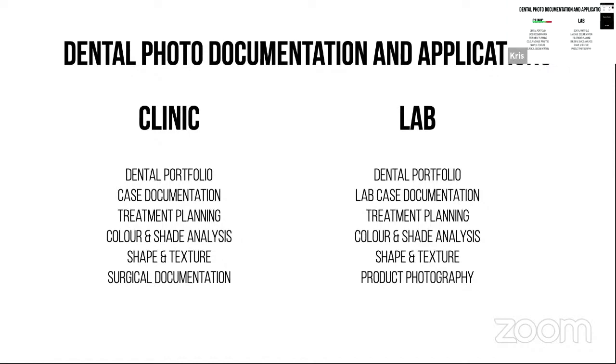clinicians, and dental technicians. And when we compare the number, or the type, of photography between these two groups, the main difference is that in the clinic, we take some additional surgical documentation and some procedures documentation related to the treatment. But in the laboratories, especially in recent years, we see that technicians take dental portfolio as well, so the set of the full documentation.